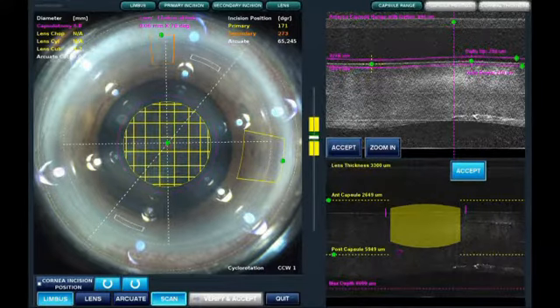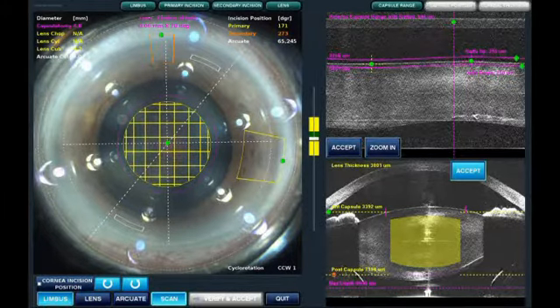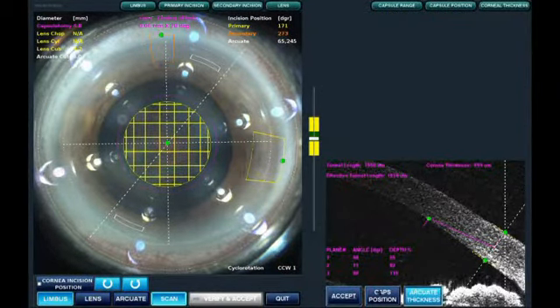You'll notice that there's very little moving of any of the markers now — everything is pretty much pre-aligned. There's a small amount of lens tilt, but not a lot. That all looks good: nice smooth cornea, no folds or wrinkles. We're going to do our arcuate incisions.